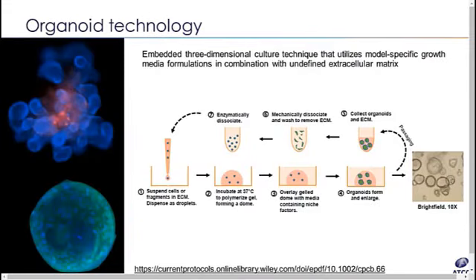So here I'm going to touch on the organoid culture technology. The technology originally came from Hans Clevers' lab at the Hubrecht Institute in the Netherlands. As it applies to human organoids, it relies on an advanced medium that can include conditioned media from Wnt and R-spondin producing cell lines, recombinant proteins, and small molecules. This diagram is an overview of the culture process.